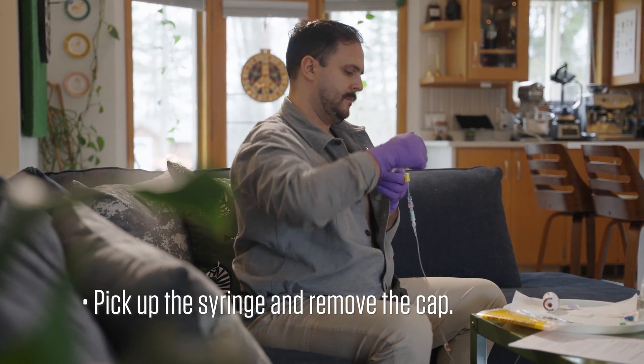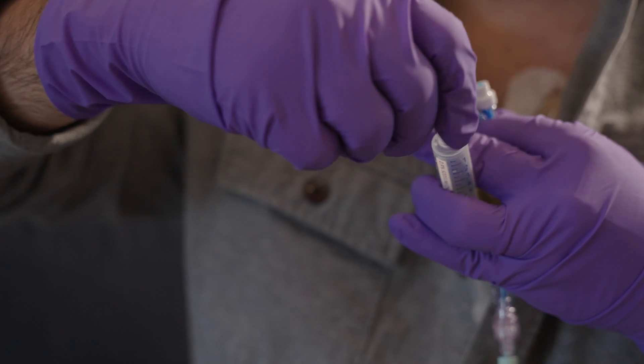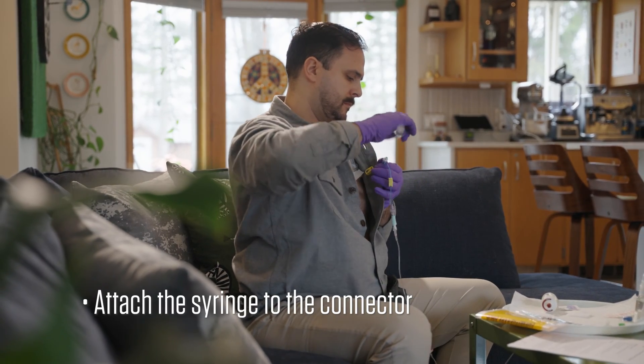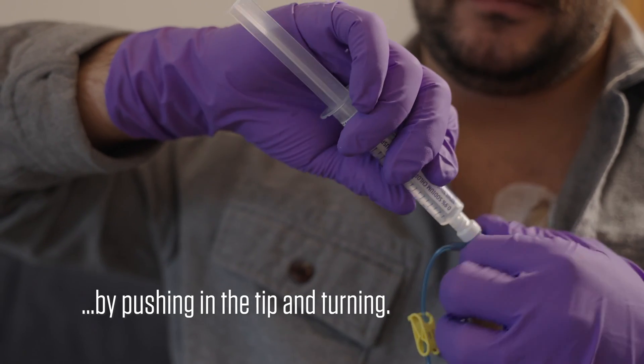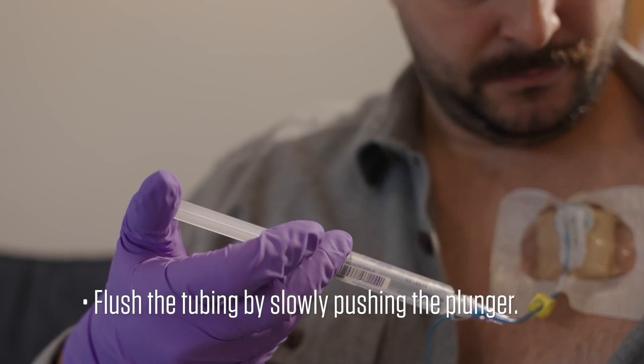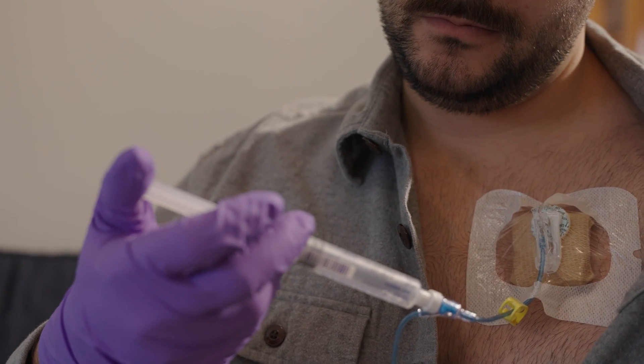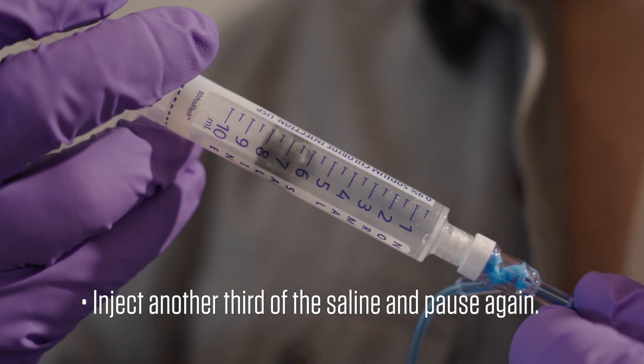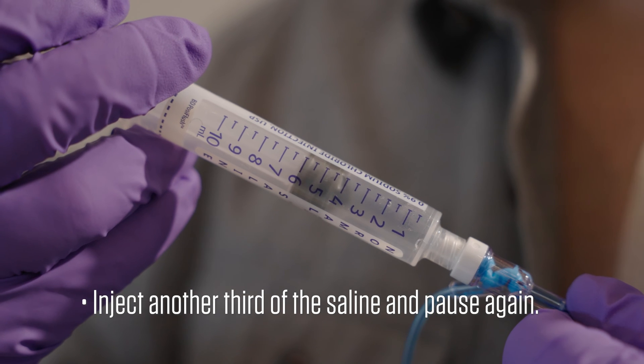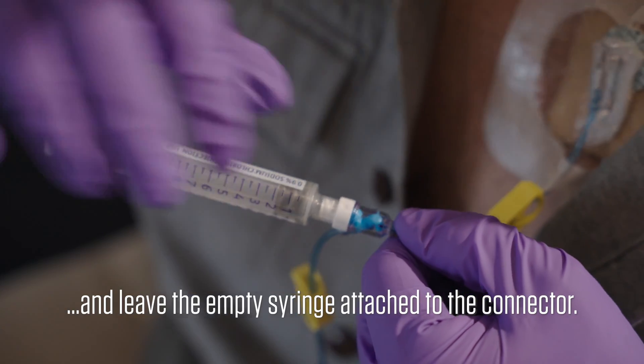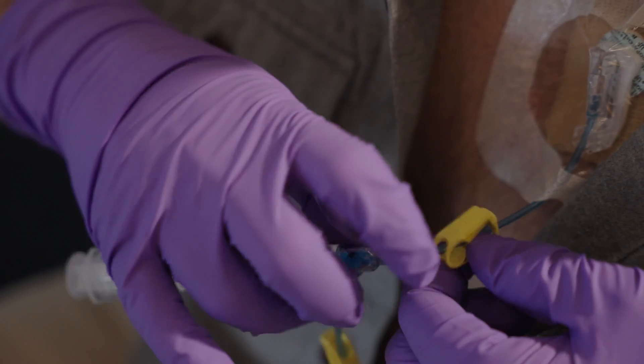Pick up the syringe and remove the cap. Attach the syringe to the connector by pushing in the tip and turning. Flush the tubing by slowly pushing the plunger. Inject one third of the saline and pause. Inject another third of the saline and pause again. Then inject the last third of the saline and leave the empty syringe attached to the connector.